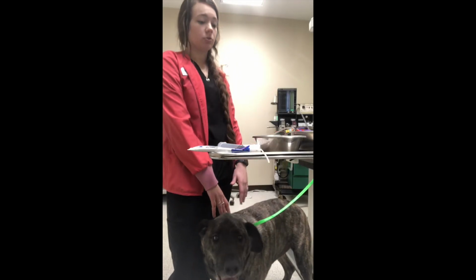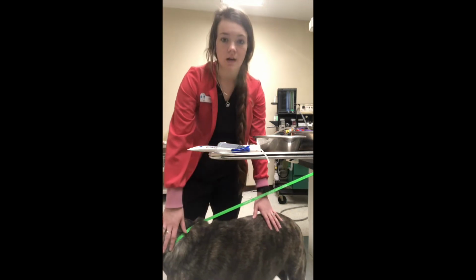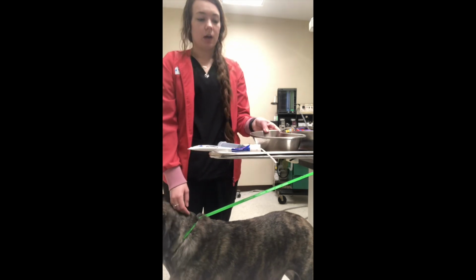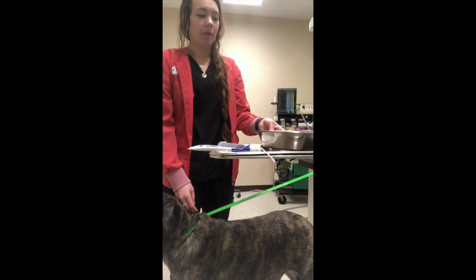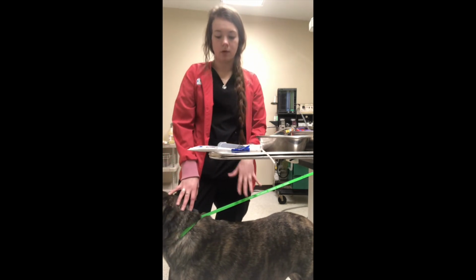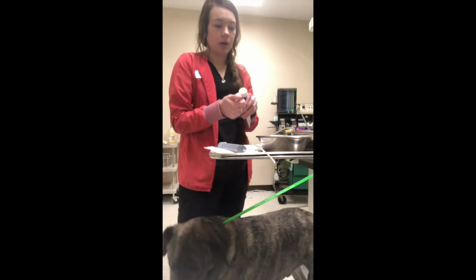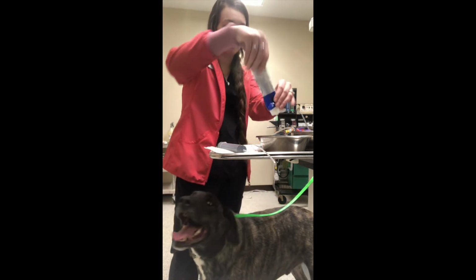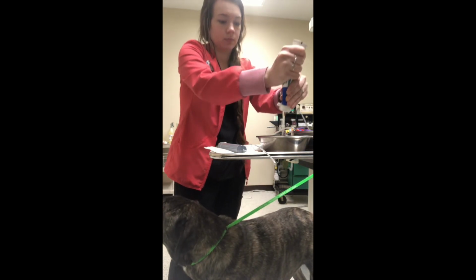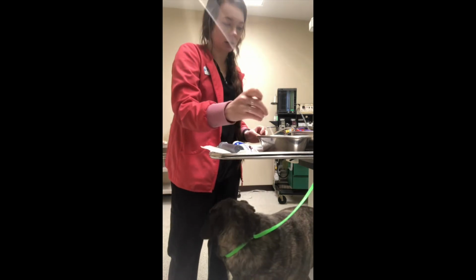Okay, so I'm going to demonstrate how I would be giving an enema. This is Sam. He doesn't actually need an enema, so we're just going to demonstrate how we would give him one if he needed one. So I have some warm water here. You want the solution to be warm, but no warmer than their body temperature. So I'm going to put some lubrication in with the water. And then I'm going to mix it up well.